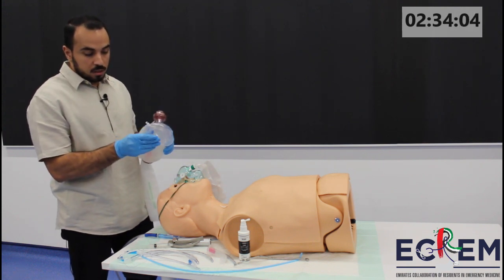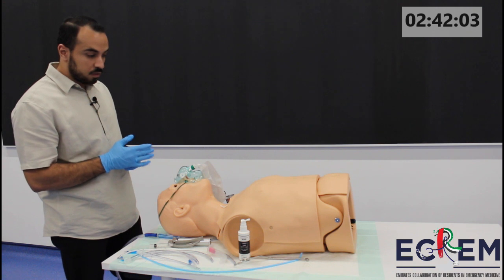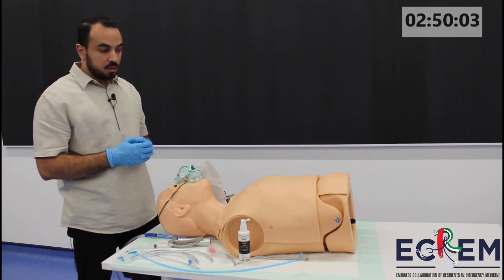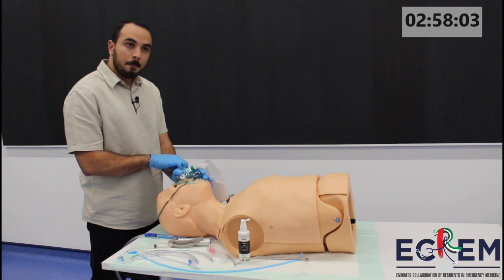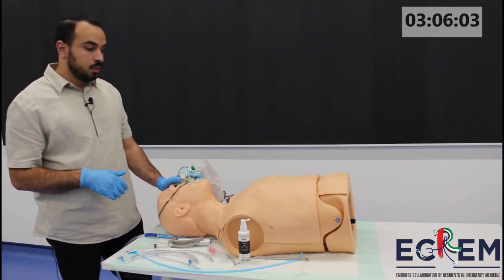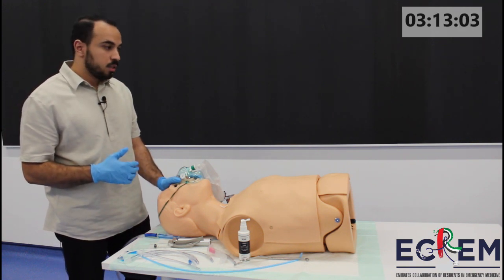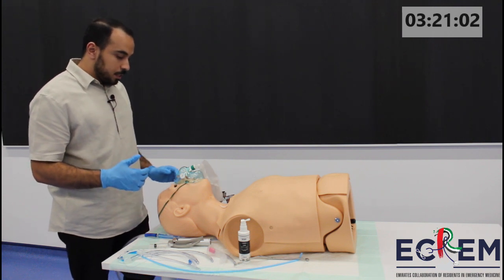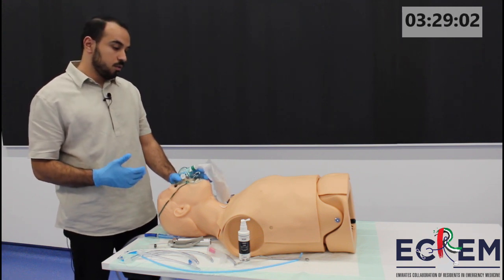We'll have our Ambu bag, making sure that the seal of the mask is there and that the bag is connected. Once I have checked my equipment and everything is available, I'll ask my team to prepare the medications. Can you tell me how many kilograms he is, please? He is 60 kg. So we'll proceed with 2mg/kg of ketamine — that will equate to 120mg of ketamine. And we'll use rocuronium as the paralysis agent at 1.5mg/kg, which equates to 90mg. The patient is already on the 15-liter mask for pre-oxygenation. We'll aim for 3 minutes of pre-oxygenation or 8 tidal volumes.